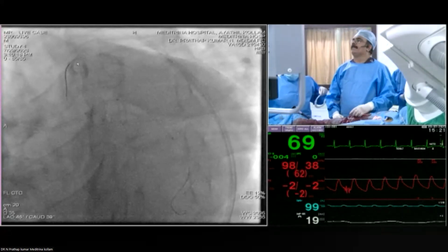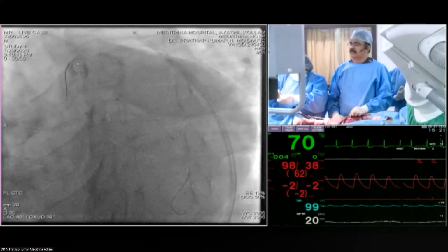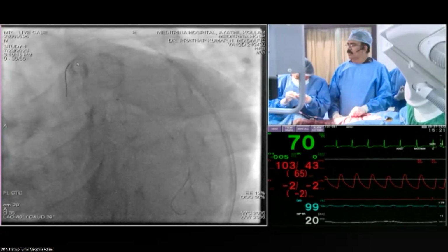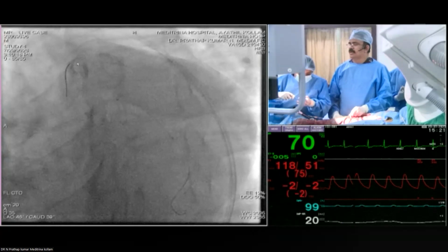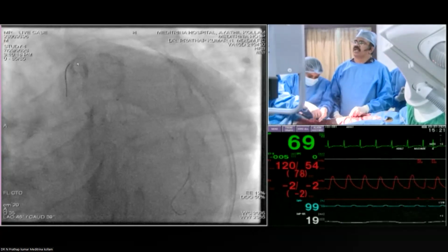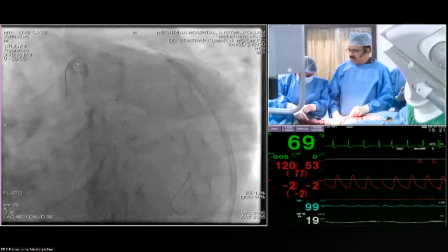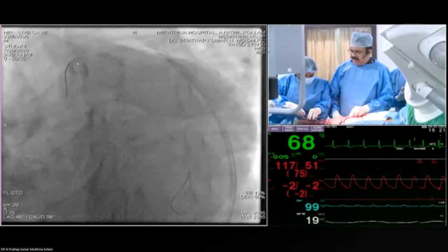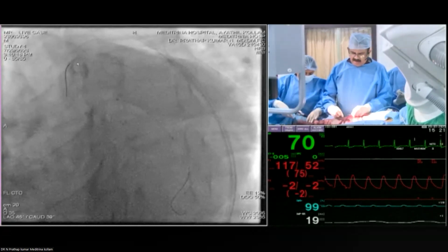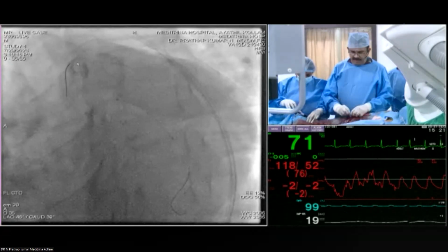Dr. Pratap, I agree with that strategy. You know, I myself would be reluctant to use just a balloon in the ostium of that circ. I think the downside is a bit scary. Moreover, yesterday, Saurav, we have seen two cases where we have seen strut going, and we cannot be as ostial as possible. And I don't want to dilate both the places and keep something there and the patient. I'm actually a little worried about that.